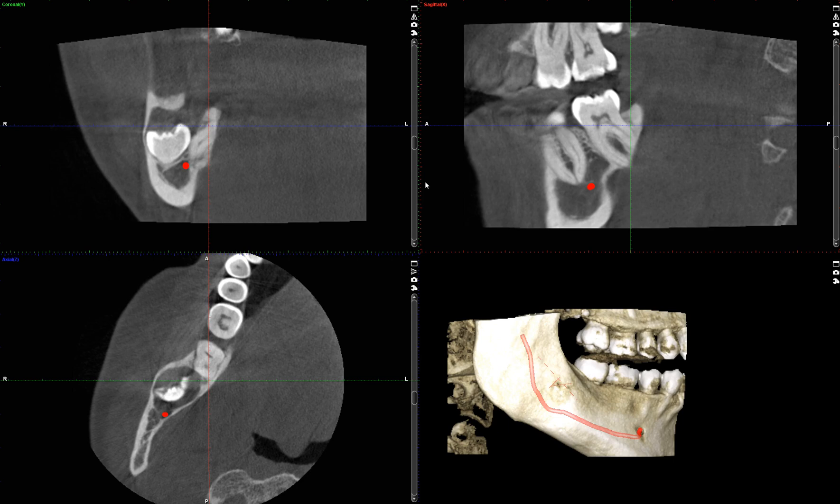That outside dentist, once recognizing that, referred the patient to our faculty practice. Our oral surgeon felt it was important to take a CBCT scan of this area to better assess the location, size of the lesion, and its relationship to surrounding structures — which I absolutely agree with. Whenever you suspect some sort of cystic or tumoral lesion, you should definitely take a cone beam in almost all cases.